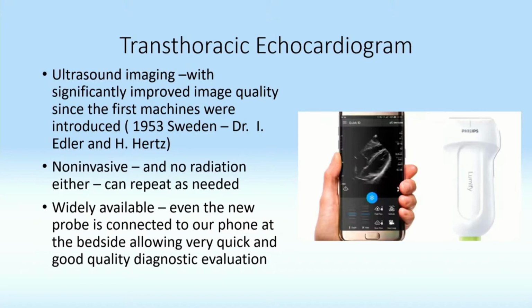Now that it's widely available, really no hospital exists, I think, in the United States where there is no ultrasound machine available. But look at this. I can actually now connect the probe, which is on the right side there, to my phone. And I can get at the bedside a really good quality echocardiographic picture rather than using my stethoscope. Nowadays, when I round with the residents, I take my echo machine and my phone with me, and I get the pictures right away. There is no waiting.